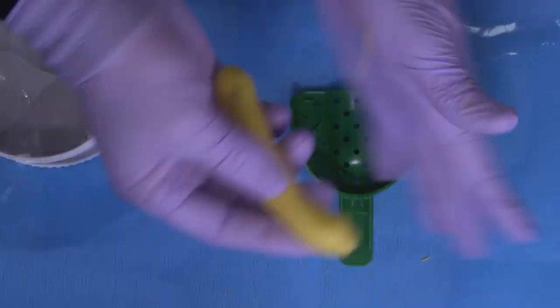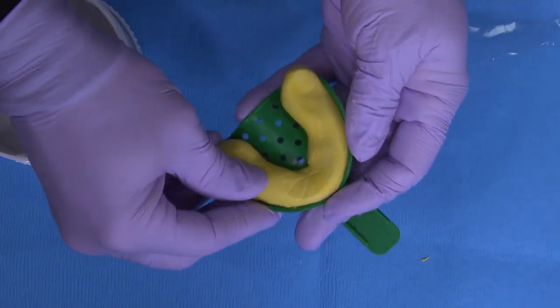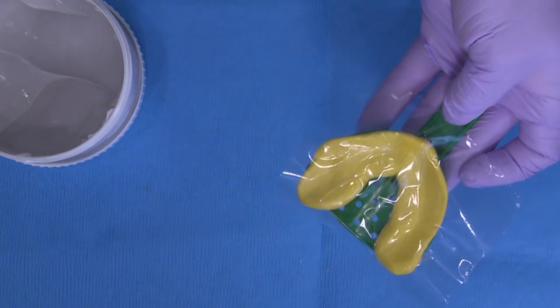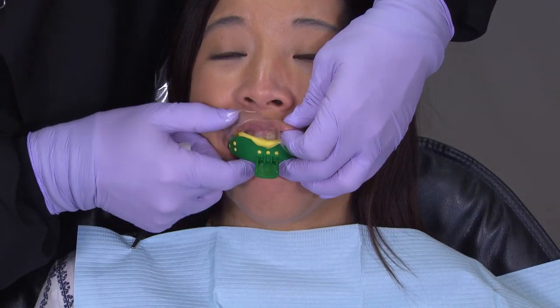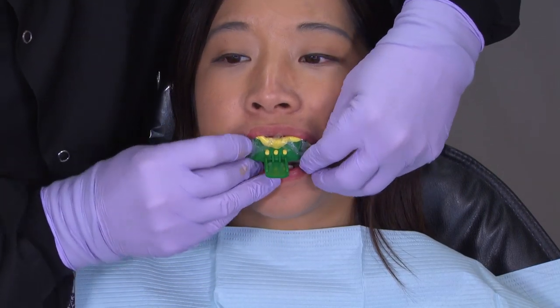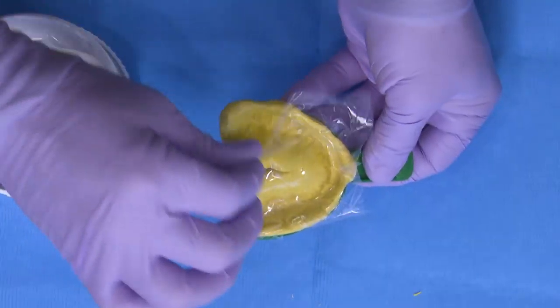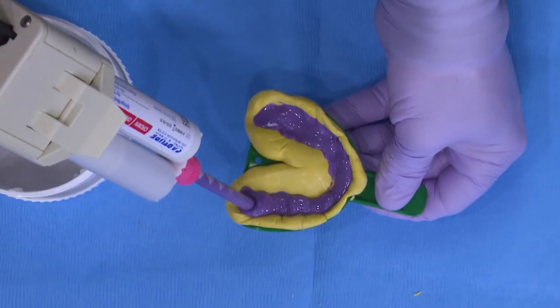The same procedure steps can now be performed with the upper arch. The putty is mixed, rolled, and then shaped into the tray. The remaining plastic sheet is placed over the center of the tray, with the center cut line over the palate area. This assembly is placed in the mouth, lips are folded over the anterior, hand pressure initially seats the tray, and then the cotton rolls bitten into place around the bicuspid area are used to completely seat it. After 5 seconds of biting pressure, take out the tray, take off the plastic, hand form the putty if needed, and then immediately begin to fill the tray with medium body VPS.